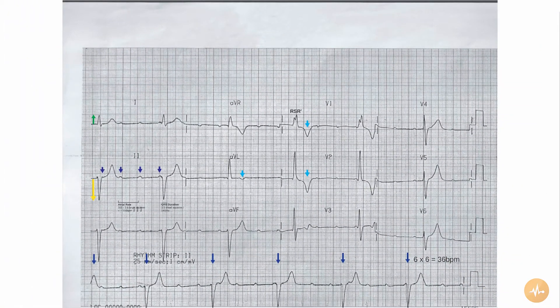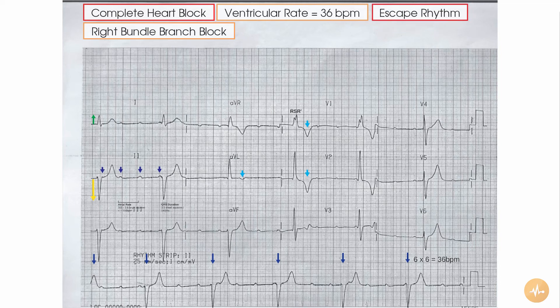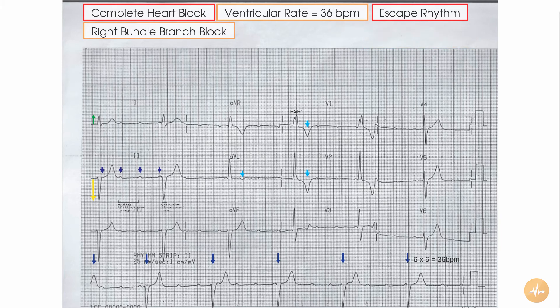The T waves are deeply inverted in leads V1 and V2 and inverted in AVL. In summary, the ECG shows the patient to be in complete heart block with a ventricular rate of 36 beats per minute and a right bundle branch block pattern. Given the relatively short QRS complexes, the escape rhythm here is probably coming from high in the ventricular conduction pathway. The treatment here is likely to involve insertion of a pacemaker.